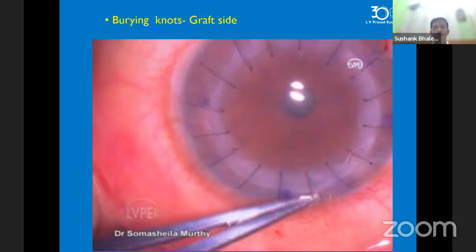I just showed two videos, and as I told, there are pros and cons of each thing. So you just need to take into account and decide, based on your experience or based on the condition, where to bury the suture.